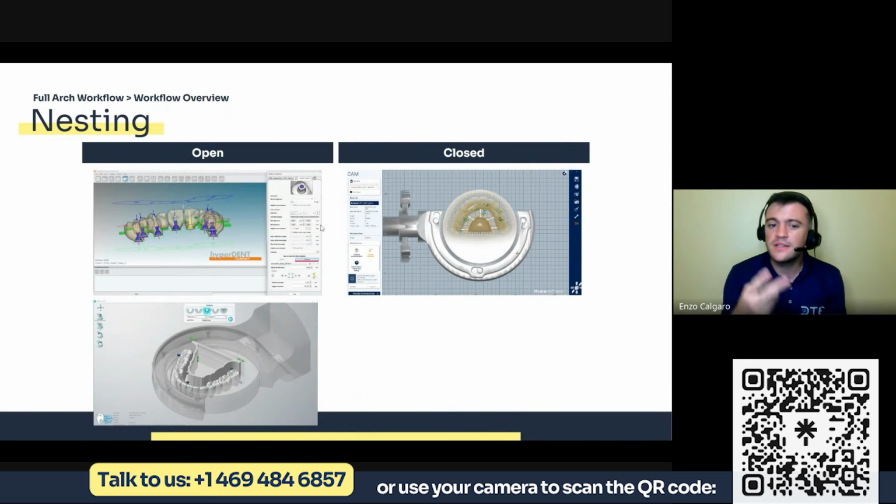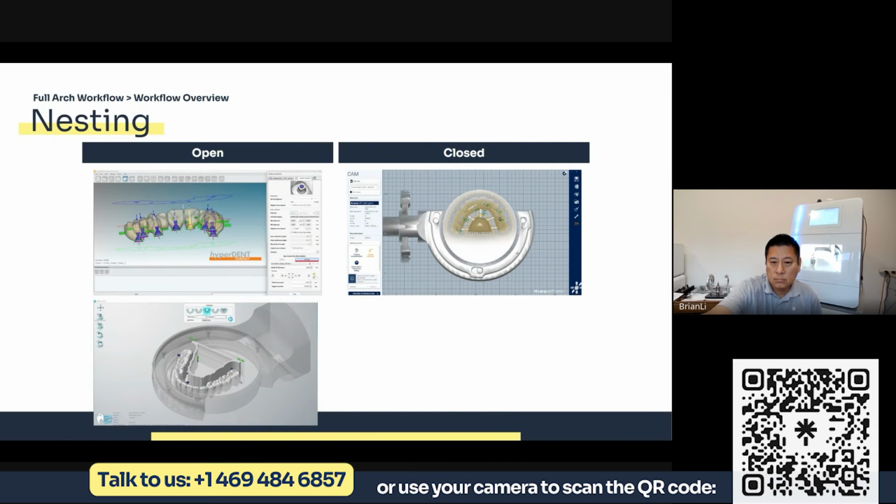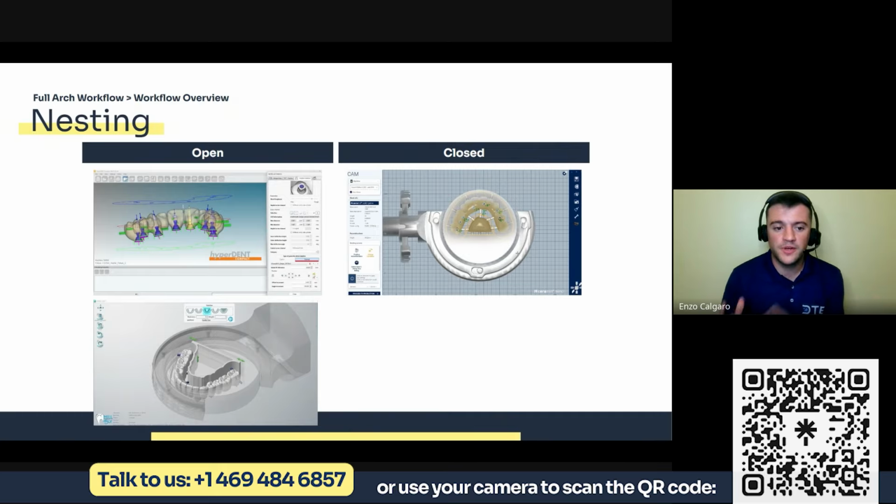And you have basically 2 options. There are a lot of different brands out there, but they're going to come down to 2 types. You have open, and I'm not going to say closed like it's written here. I'm going to say semi-closed, right? So what is the difference between open and closed?